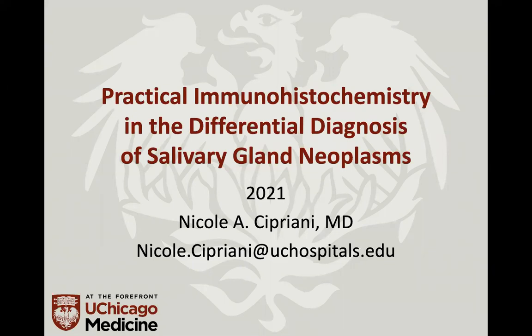Anyway, so for salivary this year, we're doing something a little bit different. As you all know, we've done our fun Jeopardy game. My prior salivary lecture is already recorded on YouTube, so I didn't feel like it was necessary to give that one again. So today we're going to focus specifically on immunohistochemistry in salivary gland tumors. And next week we're going to do core biopsies, which is organized by myself and Katie, because differential diagnosis on core biopsy can be challenging, and hopefully you can use some of these immunohistochemical techniques to inform your differential diagnoses.